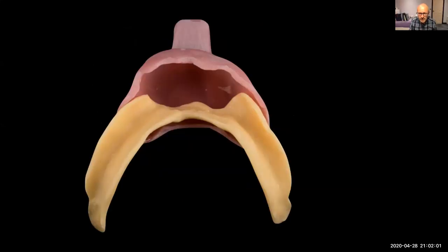They're brilliant, these things. The beauty about this is that I can do the distal extension freehand saddles. I can do those impressions without the front teeth getting in the way of the impression. It's fantastic. So what I do is I put green stick just on these borders here and here and mold it in the mouth, and do all various movements. I'll show you that just in a sec.